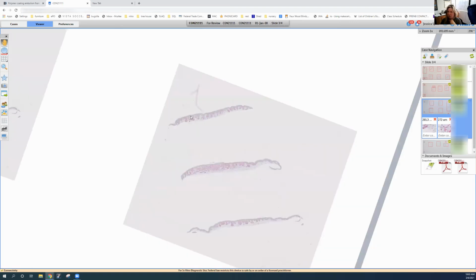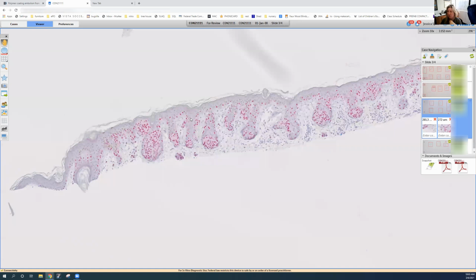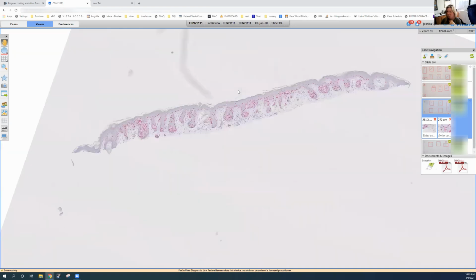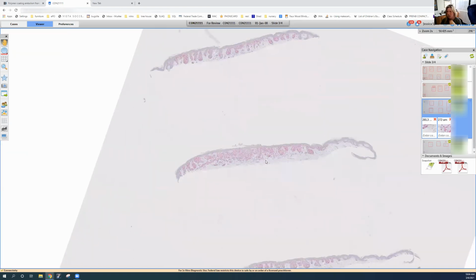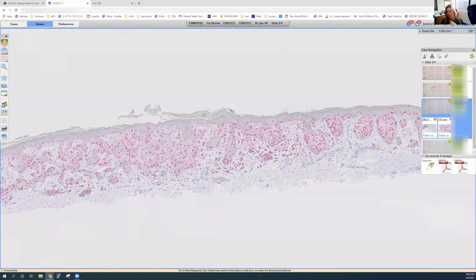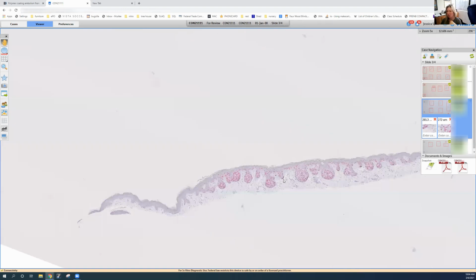So I showed this case around. I thought that this was probably a very sneaky, mostly nested melanoma. And we could not come to a consensus in our practice. Other people thought, this PRAME stain, it's new. I'm not sure I totally trust it yet. It really looks like an atypical nevus at first glance. So we were kind of divided between atypical nevus and melanoma.